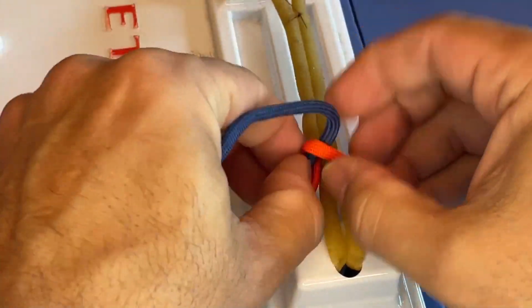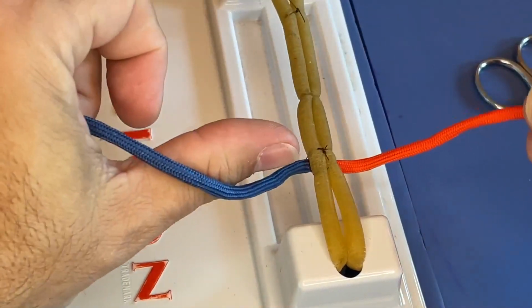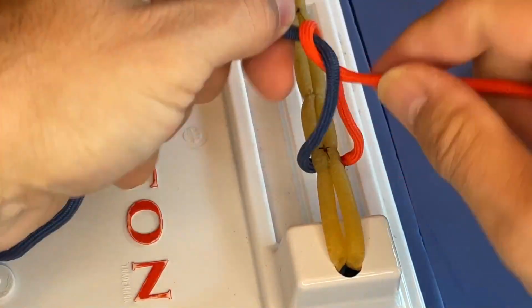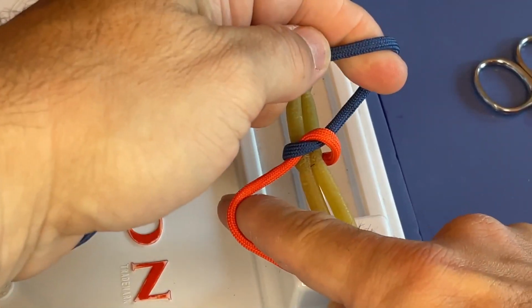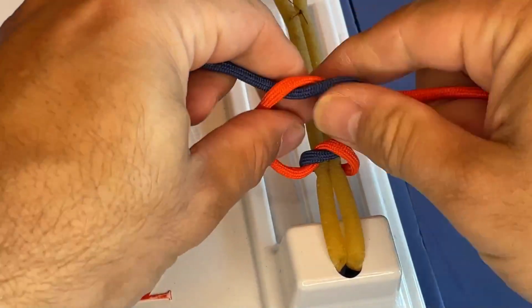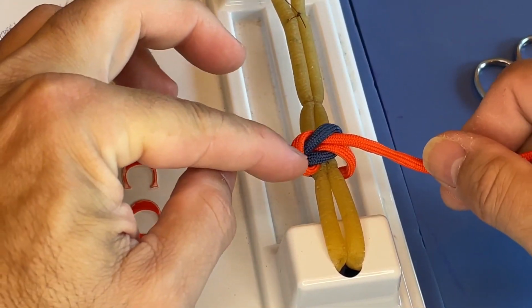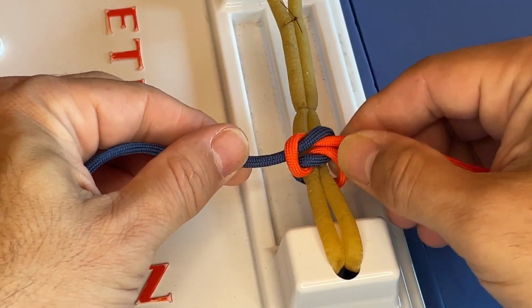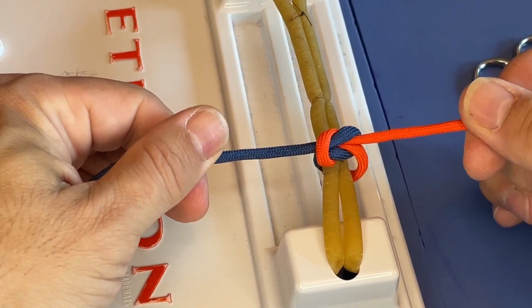So let's just undo this and we'll look at that again. So again, I start off with around my thumb, pinch, bring it through, do that little bit of a crossover. You can see that lays down nicely there. Over my finger, pinch, swing it through, and then lay that down. So again, we've got orange loop with the two blue strands going through it, and then over here the blue loop with the two orange strands closer to the camera. And then it's just repeating that.